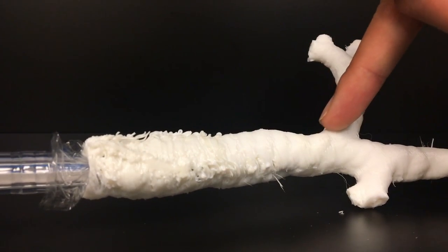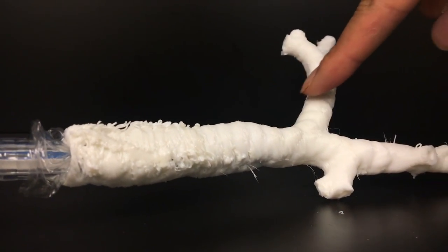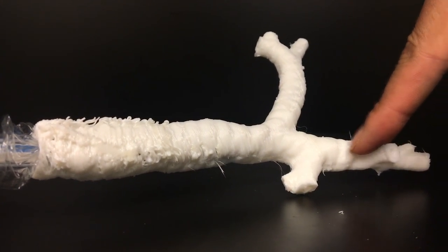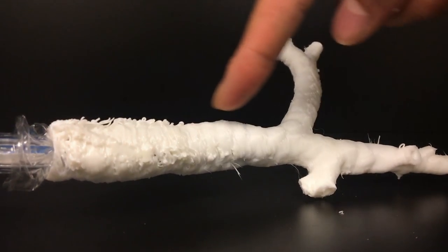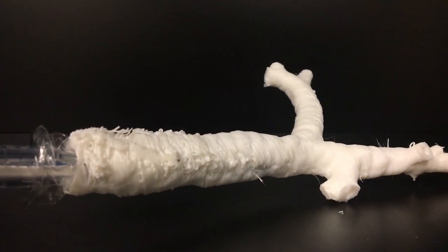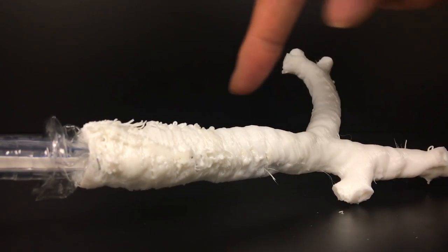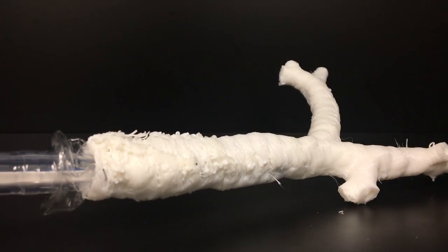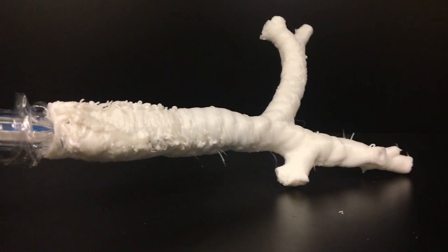Ideally, you'd want to have your bronchoscope be able to travel down the left and the right main stems so that you could be able to see here. In this case, the 37 was just a little bit too big to get down into your bronchi, but you could just downsize from here because you know that 37 will fit right down the trachea. So maybe like a lower gauge will actually allow you to go inside the main airways.